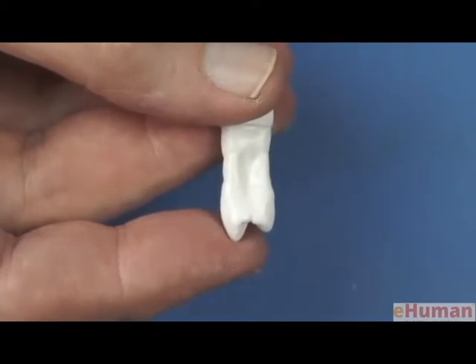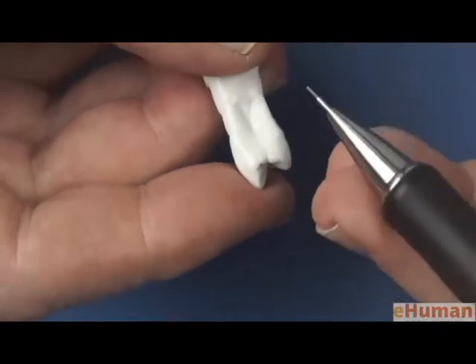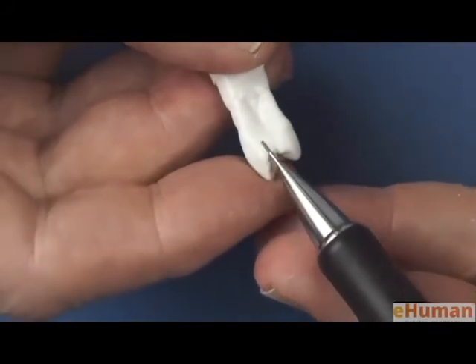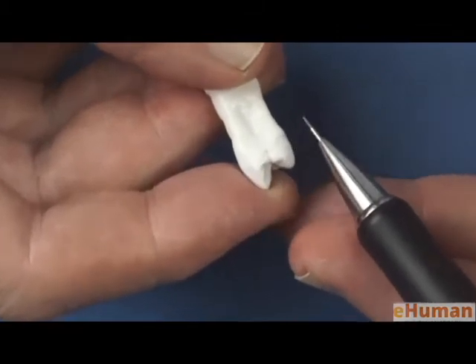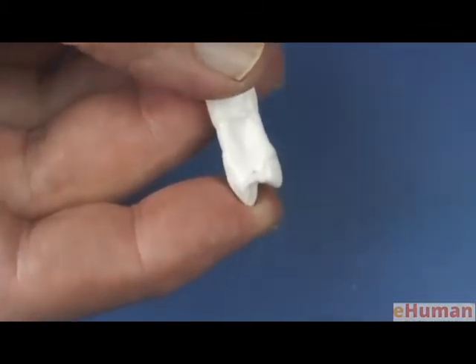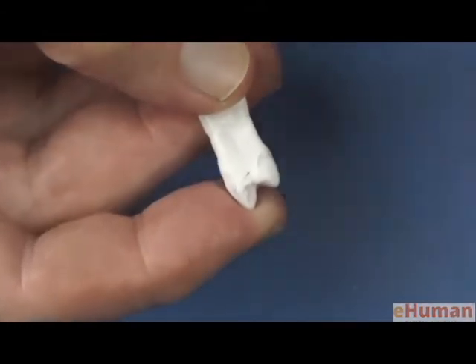As we've done before, we'll start with the pencil and mark the height of contour by going around the proximal surface of the tooth from mesial to distal, the line showing the height of contour on that surface.